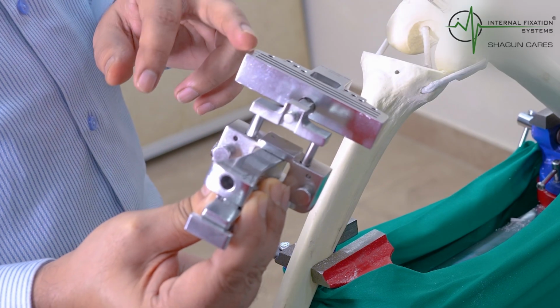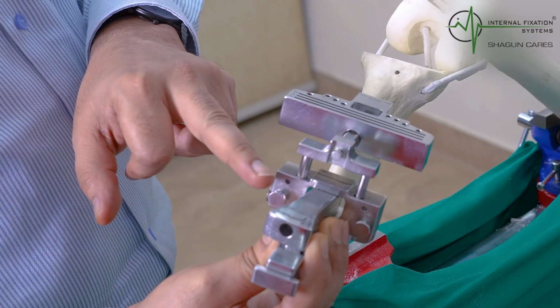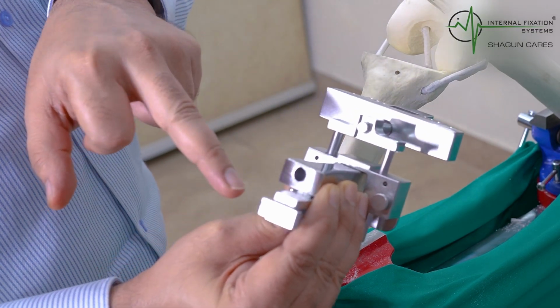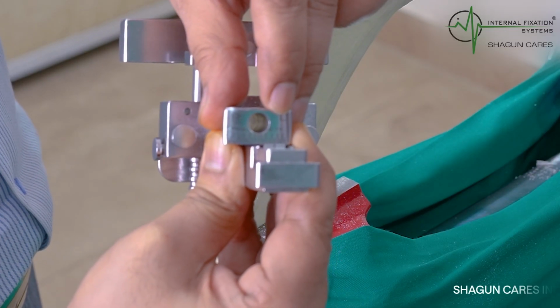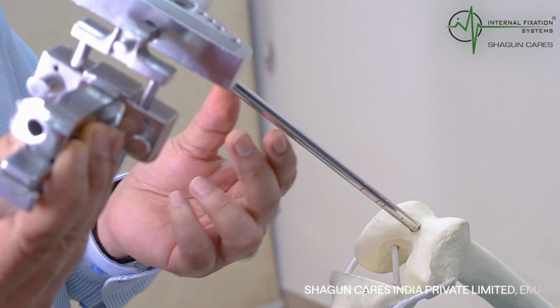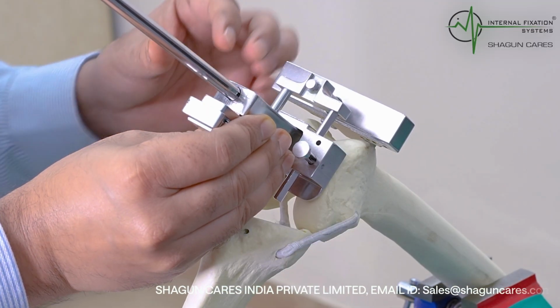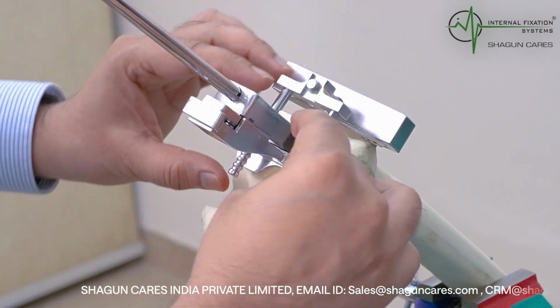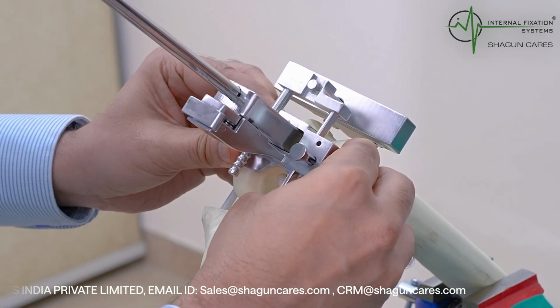Now we are going to take the distal cut over the femur, for which we have arranged the implants, where we have a 6-degree valgus. You can see here, if you can focus on this, there is a 6-degree valgus. These are the cutting jigs. So we are going to enter it. You need to adjust that it should be in the center.